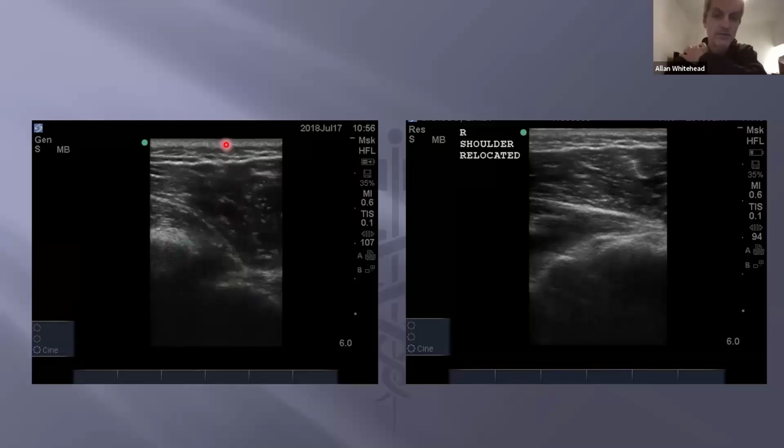which you've placed posteriorly. Come to the right image on the PowerPoint presentation for the same patient, post-reduction or relocation, looking a lot better with the humeral head and the glenoid almost perfectly aligned. Again, the humeral head is slightly closer to the probe, slightly more posterior than the glenoid lip, which is the most common situation, but very happy that the ultrasound shows that it's been reduced.